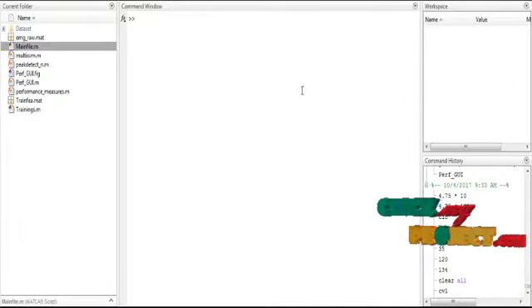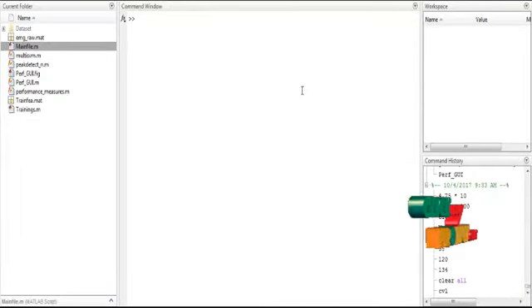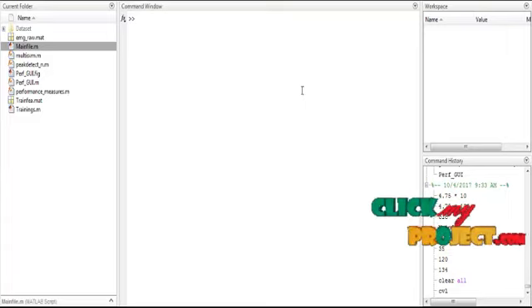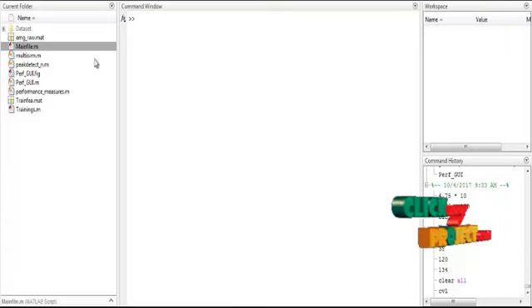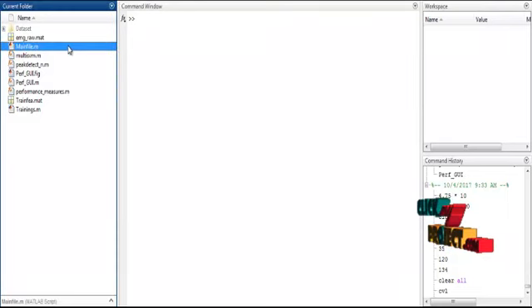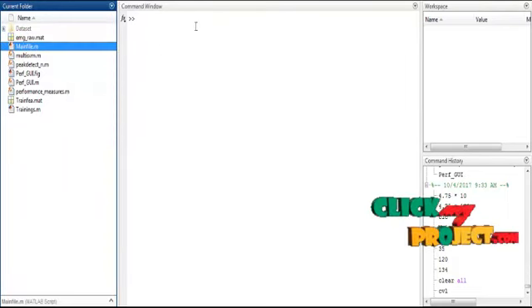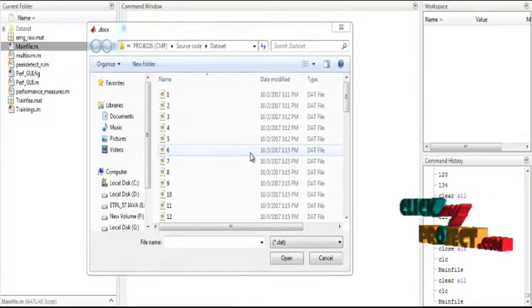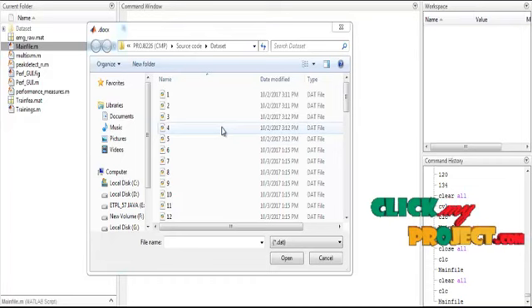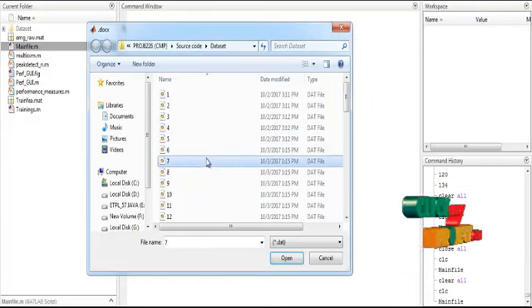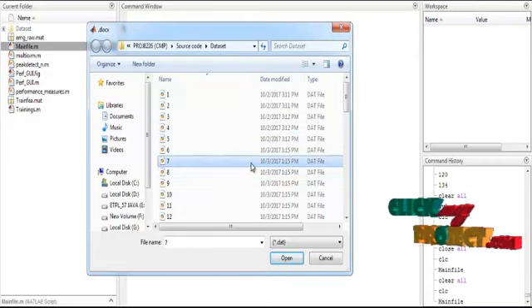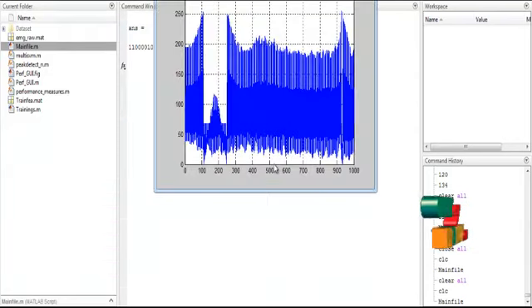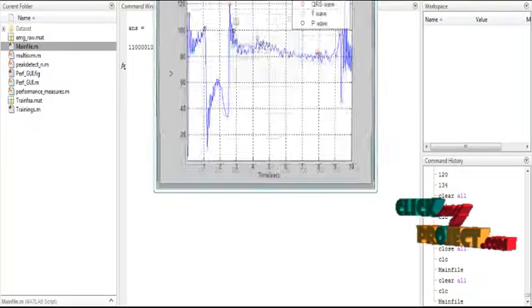Now we will discuss the initial running procedure. First, open MATLAB 2013 and change the current directory. To execute the code, right-click on 'main.m' and select the option 'Run'. The dataset folder will open, showing several signals. Select any one signal, click the 'Open' button, and the process will run automatically.